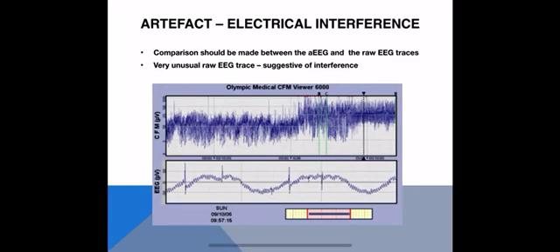Here we can see electrical interference on the CFM trace: the baseline rises up and when we compare this to the raw EEG it looks really unusual, which is suggestive of interference from equipment. You might see this sort of picture if a baby is on high-frequency ventilation.